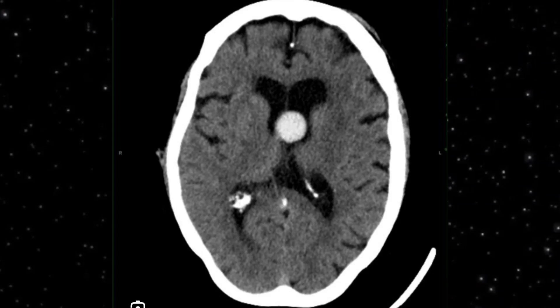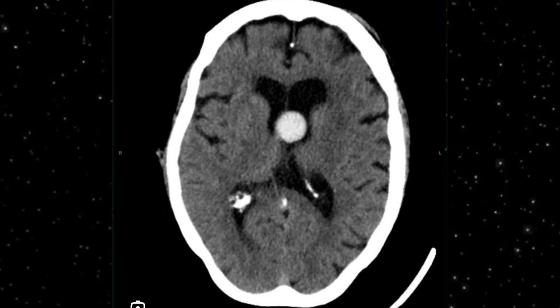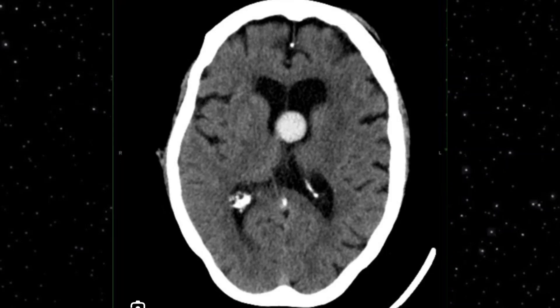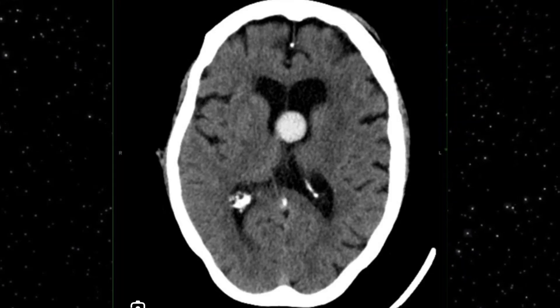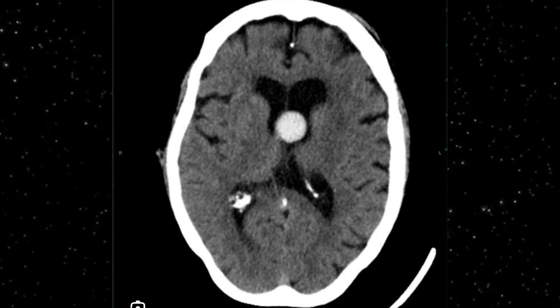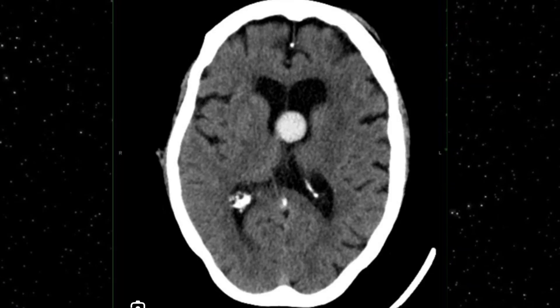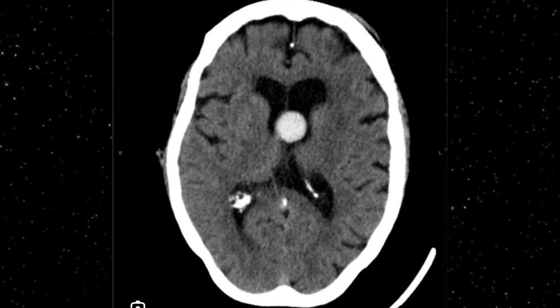Another example: a CT axial image showing a well-defined, spherical, characteristically hyperdense lesion within the third ventricle, in between the third and lateral ventricle. Here you can appreciate the colloid cyst between the lateral ventricles. In the previous image it was too small without any significant hydrocephalus, but here it is causing significant obstruction. Because of the obstruction, hydrocephalus is clearly visible — both anterior horns of the lateral ventricles are particularly dilated.